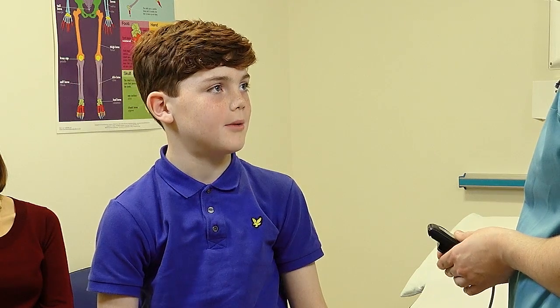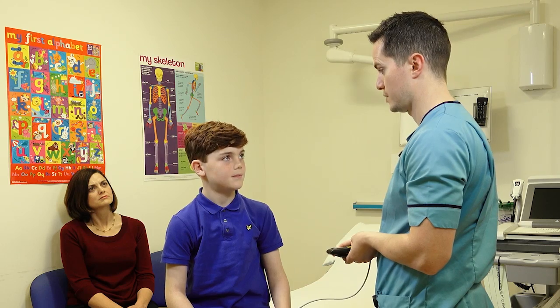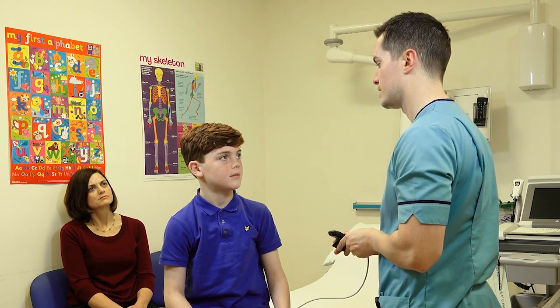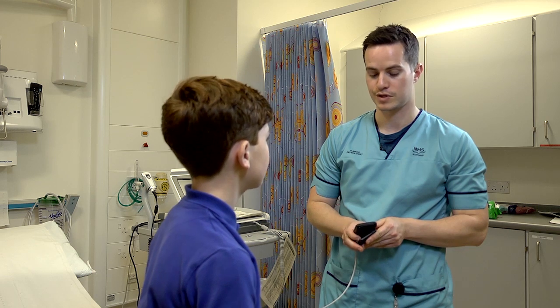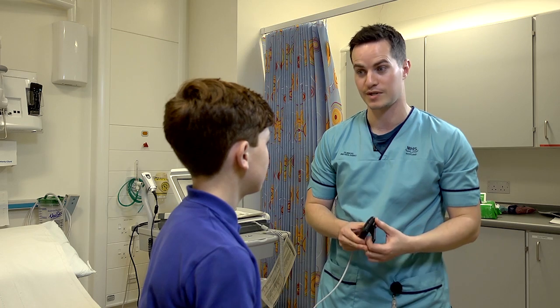How long do I need to wear the monitor for? This monitor you're wearing, you'll wear it for the next 24 hours — until this time tomorrow. We do have other monitors that last for a longer period of time: some last for 48 hours, some last for a week, and we've even got ones that last for a month.